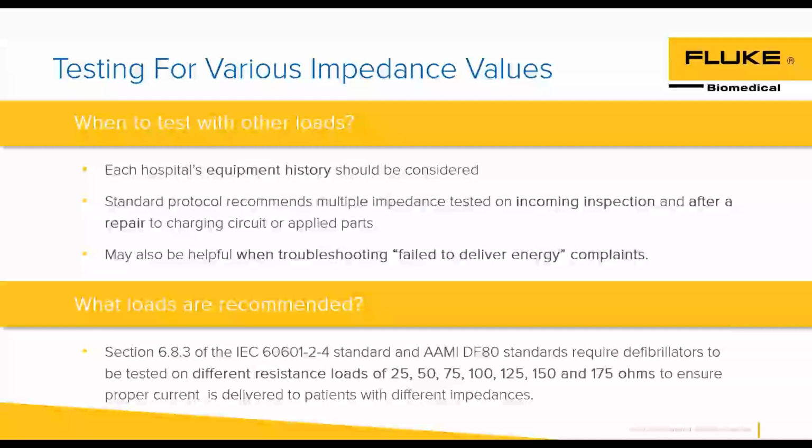You might find that there's a chart at the end of the discharge test that lists out the different resistances they want you to discharge at and what you should read as the joule output. So incoming inspections, for sure, I definitely want to test then. And anytime I'm doing a repair to the charging circuit. Some of these shops like to tear into equipment and troubleshoot things. If I'm putting it back together, you really should think about going the whole way through and doing all those resistance output testing.